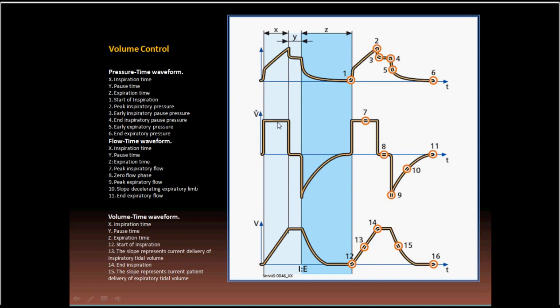Here this is the pressure. The flow, no more flow, came back to 0. And this is the time lag for the inspiratory pause. And after that starts the expiratory flow. The expiratory flow will for sure start from the plateau pressure and then go. This is a passive flow, and it depends on the expiratory resistance and the compliance of the patient, and takes its time in what we call the expiratory time constant.